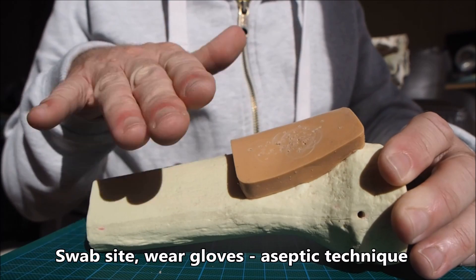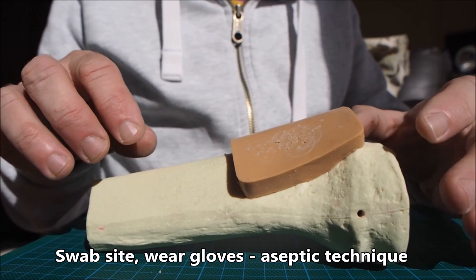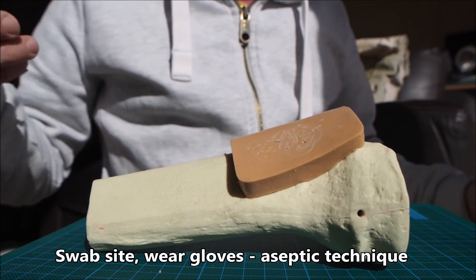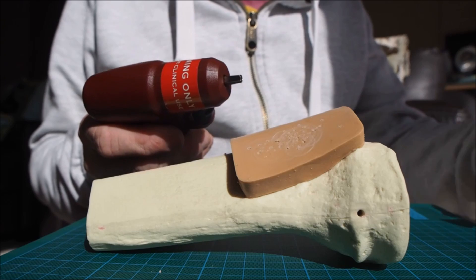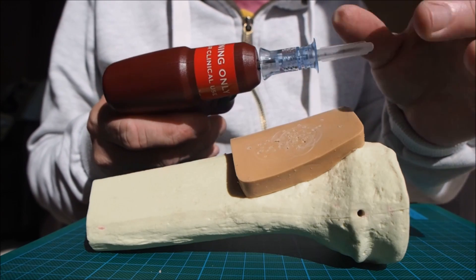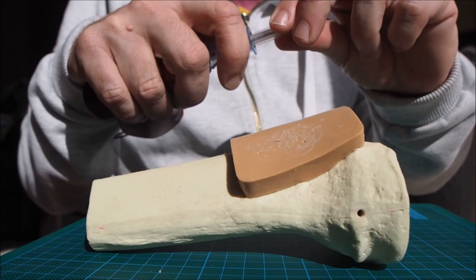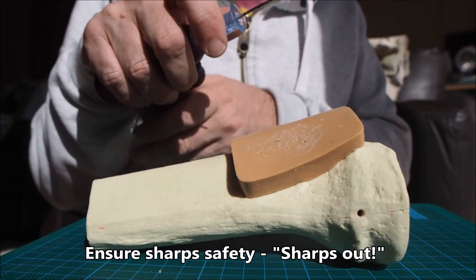We would obviously give that a swab, make sure it's nice and clean, and make sure we've got all our equipment prepared. We can then take the drill and insert the needle on — that connects just with a little magnetic click. You can take the cover off the needle, so sharps are clear of everyone. Make sure you're safe.